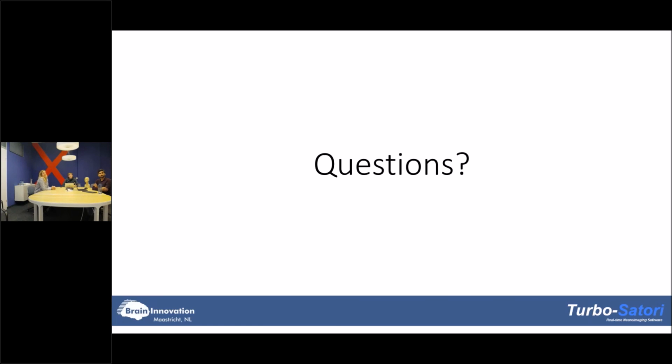Regarding the hardware section, are you there? No, I'm one higher. So the machine learning, the support vector machines, is the only machine learning tool that we have right now. If you use the support vector machines, then yes. The other tools are not using machine learning at the moment.